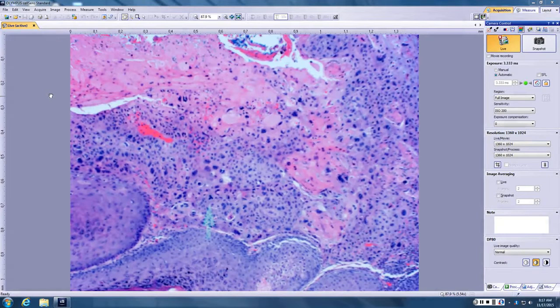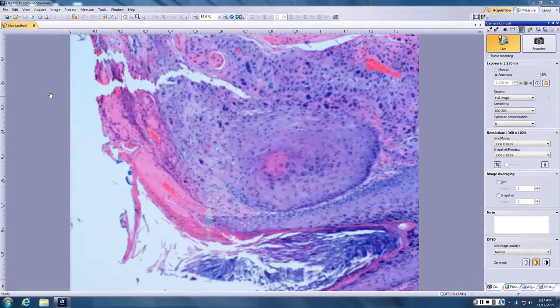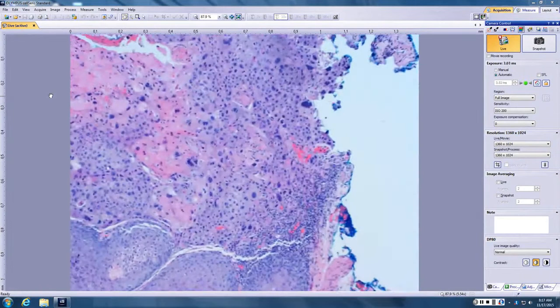And the highly malignant population appears to be coming off of the benign epithelium, has lots of pink, suggesting it's keratinizing. So, what do you think? Just a very, very poorly differentiated squame. Yeah, poorly differentiated squamous.